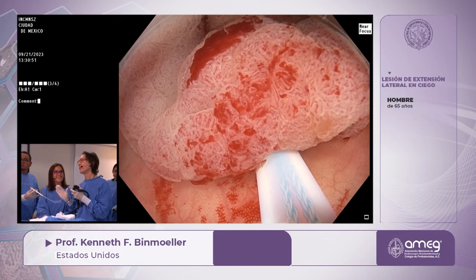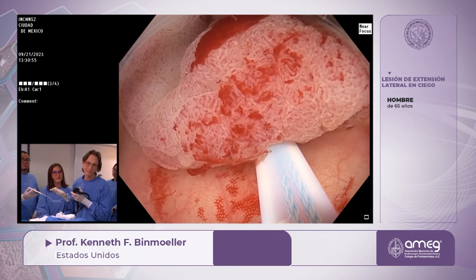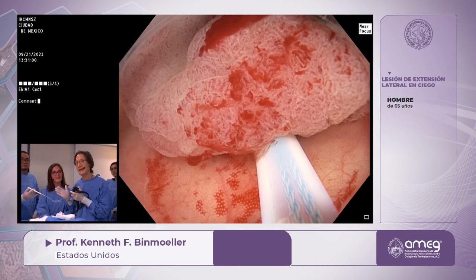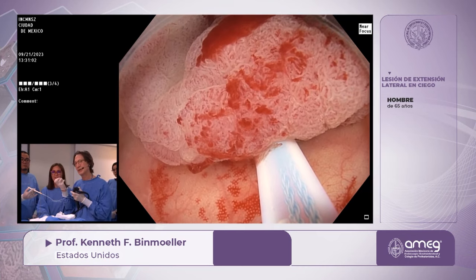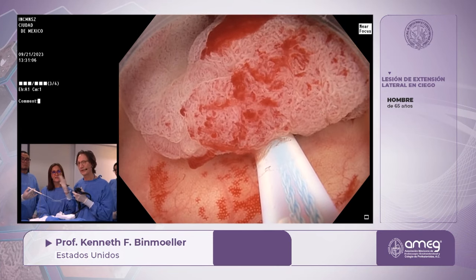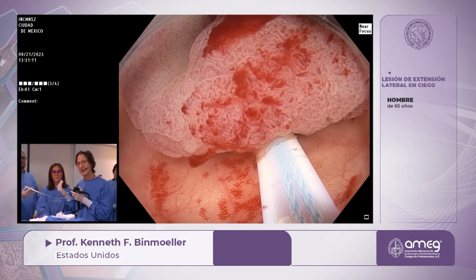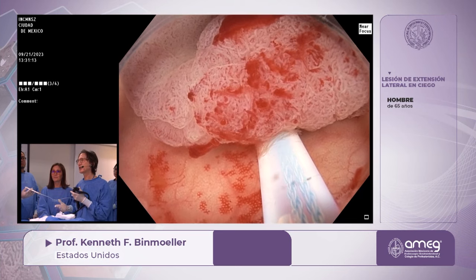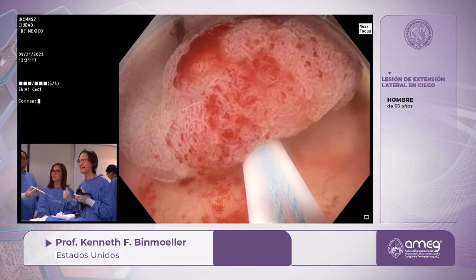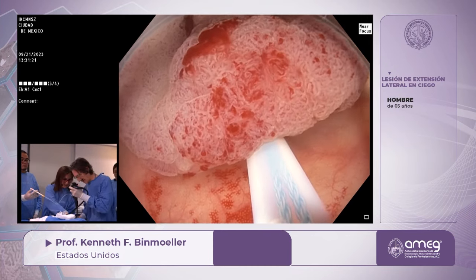However, we always want to be ready for any complication like bleeding. Now, I don't think we'll have perforation, but bleeding definitely is a risk because this is very vascular and very villous. So we have coag graspers or hot biopsy forceps, which is what I use, ready. And we have clips ready, and so we can manage any complication. All right, enough talking. I've given it some time to sort of cinch up nicely, and now I've got my pedals here.